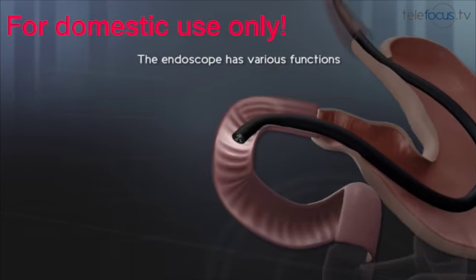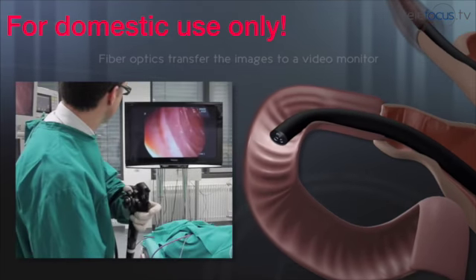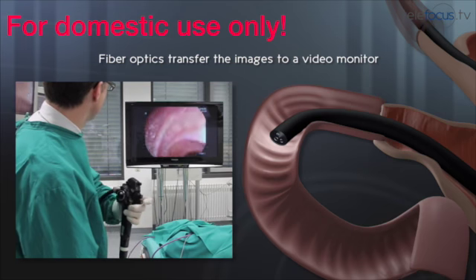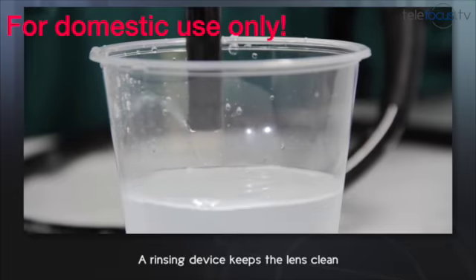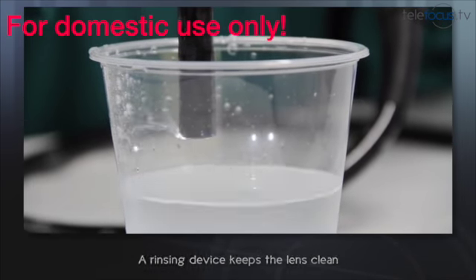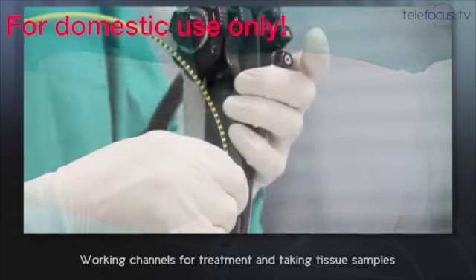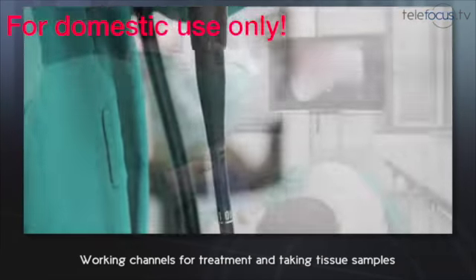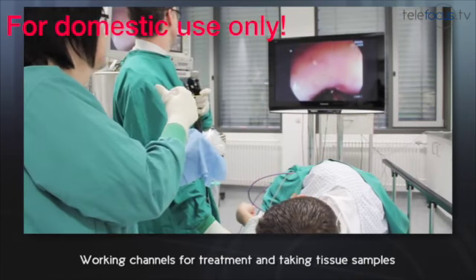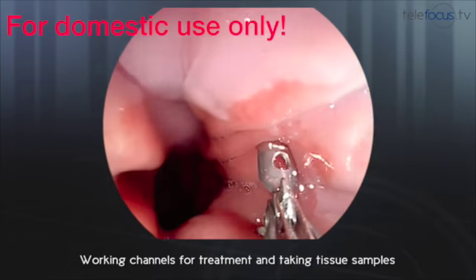The endoscope has a variety of functions. The fiber optics enable the endoscopist to view the images on a TV screen. Furthermore, the endoscope has a rinsing device for keeping the optic clean, a light source, and channels through which various tools can be inserted. It allows the physician to take tissue samples of the mucous membrane or to accomplish minor surgical procedures.